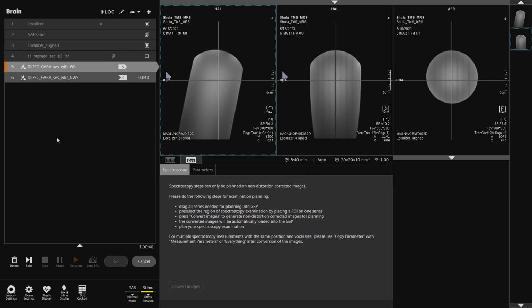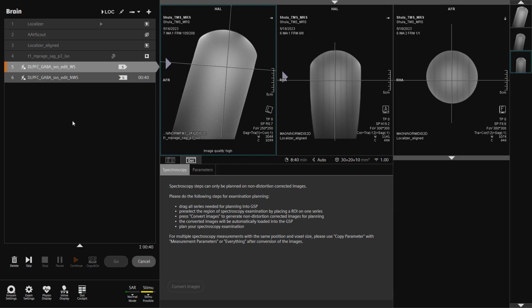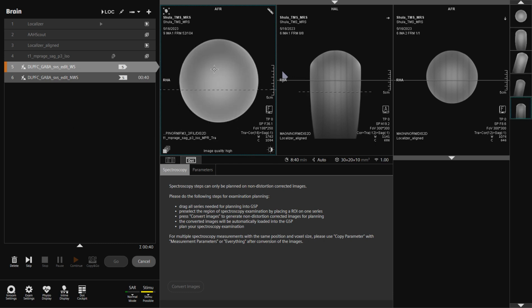Once the T1 ends, we'll show you where everything is. Just a moment. So we're going to wait for the T1 to reconstruct. And there we go. Now that it has, you can see this three stack of images here. First, you'll notice that nothing looks right.